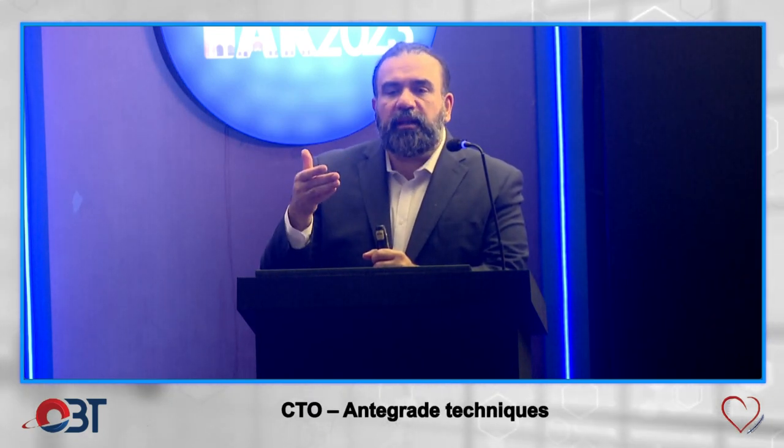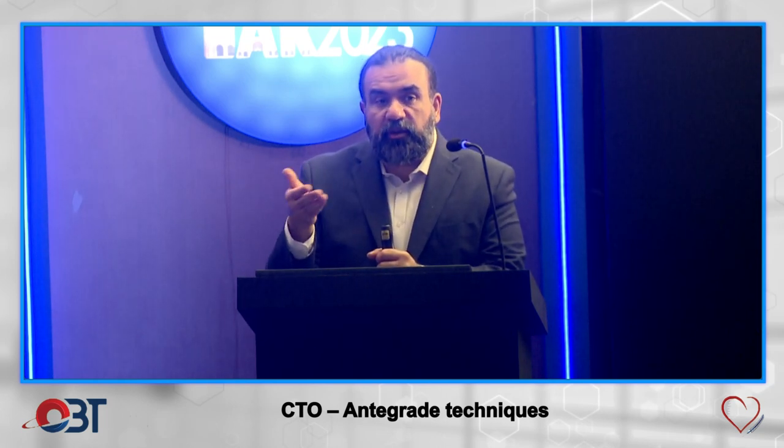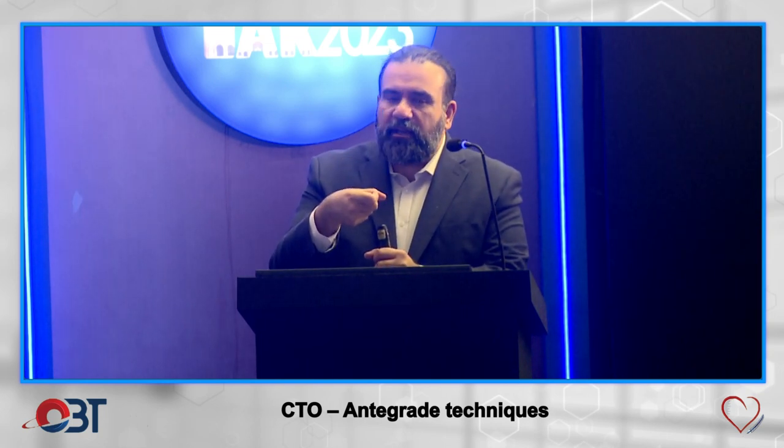So usme ye hai ki jab aapne again wire thi, now you're flushing, you take the wire out, aapne contrast lagaya upar se. When you start aspirating, if you start getting blood back, then probably you're proximal to the cap. Because cap mein agar aap hain, to CTO mein se blood nahi aana chahiye. Or like he said, maybe you've already crossed the CTO, chota CTO tha, and now you're getting blood from the other side. But more likely, if the wire is not going, side branch mein hai. But if you don't have any bleed back, then you know you're in the cap, and then you can inject, and that's the Carlino.